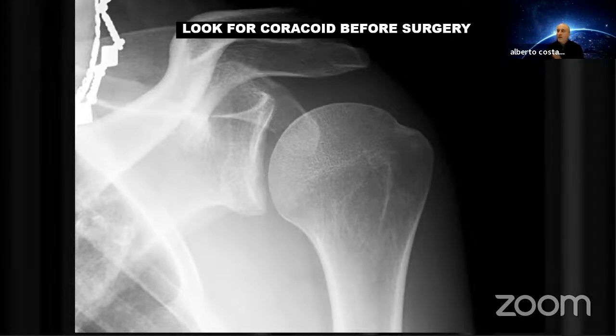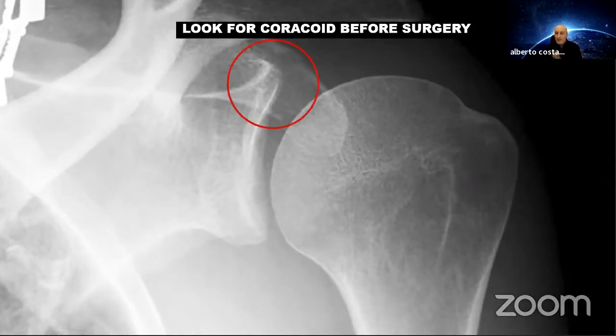So let's start with the core of the talk, which is the tips and tricks of the Latarjet. This is a shoulder that we saw before a live surgery. And if you see, there is a fracture in the coracoid. So please, when you decide to do a surgery, look carefully at the X-rays, because they give you a lot of important information. In this case, we are lucky enough because the size of the coracoid is bigger, and we are able to proceed with a normal Latarjet, and also we have the osteotomy already done.